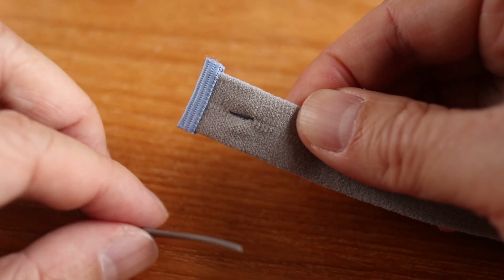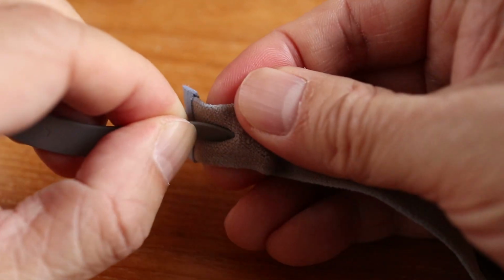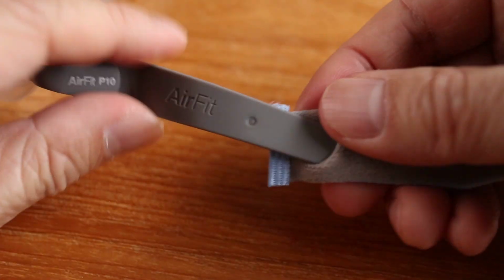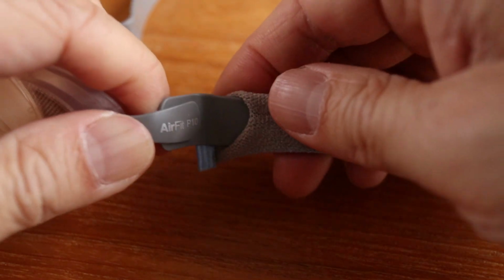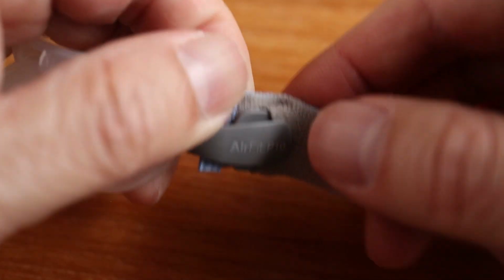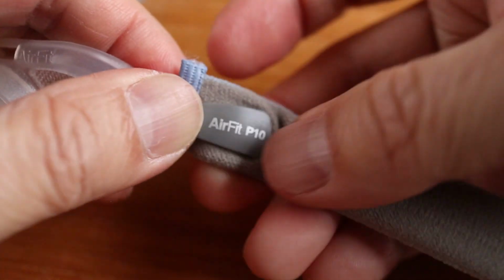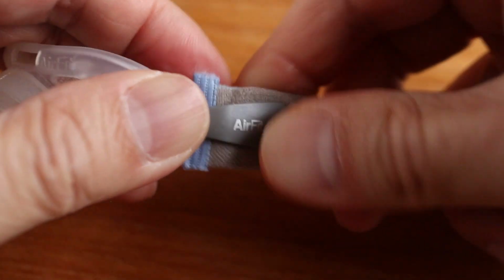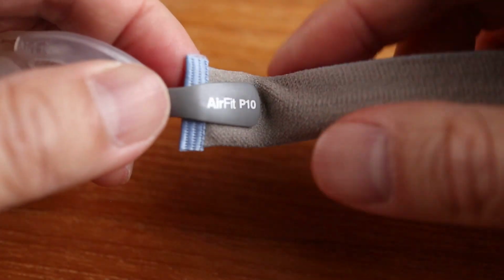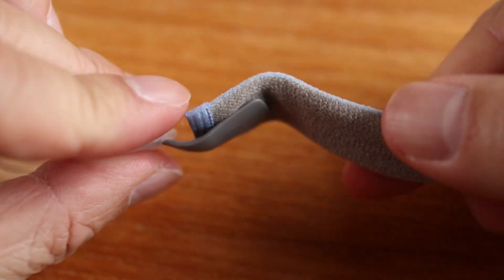Here, locate the slit in the fabric and insert the plastic arm into the opening like this. When I get to the end, I'll slip the large gray tab into the opening on the headband. I had to wiggle and pull on it a little bit, but eventually it will slide in and stay in place. So far, it's looking really good and I know it's not going to come off.